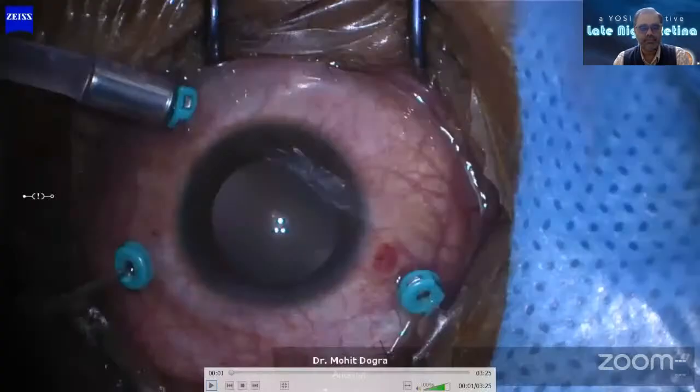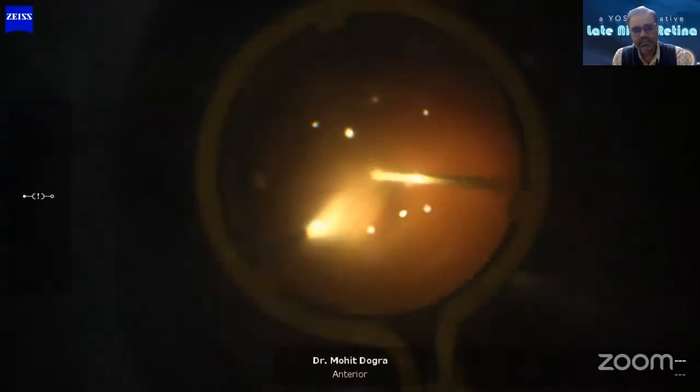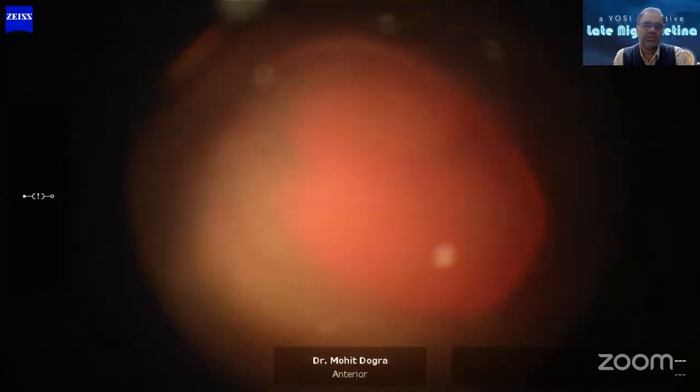The main aim of our surgery was to displace the subretinal bleed from the macular area so as to identify the primary pathology and to treat it. So a 25 gauge pars plana vitrectomy was planned. Currently, we are doing core vitrectomy. PVD was induced and peripheral vitrectomy was done. After completing posterior vitreous detachment, we can see a sub-ILM bleed on the superior arcade, which was aspirated using a cutter. We can see a flimsy ILM over the pre-retinal bleed.